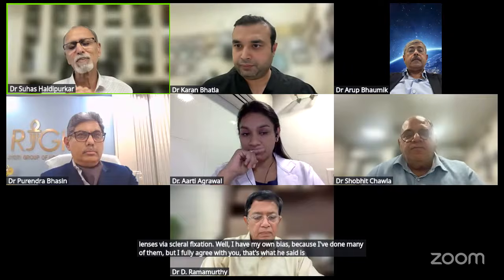But I have seen that a lot of these cases are today done by VR surgeons. And like you say, your approach naturally is to go from posterior, do lensectomy and fix the lenses by scleral fixation. Well, I have my own bias because I've done many of them, but I fully agree with you. That's what you said is the way forward, and people are doing it.